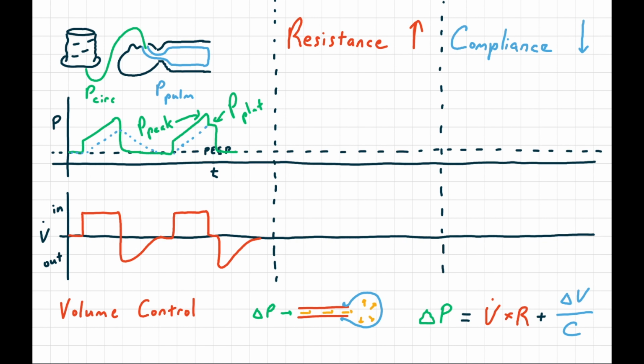So the ventilator, starting down on the volume flow graph, is going to do what it always does. Start at zero flow, go ahead and give a constant flow breath, then give an inspiratory pause, and then allow for expiration. The circuit pressure at the beginning of all of this is at PEEP, in equilibrium with pulmonary pressure, and then the pulmonary pressure, as the lungs are distended by the tidal volume, is going to increase as normal.